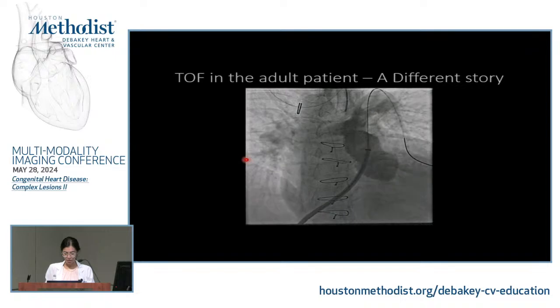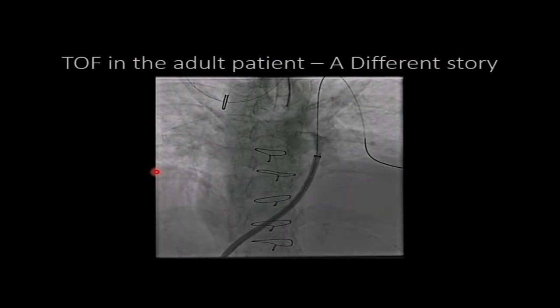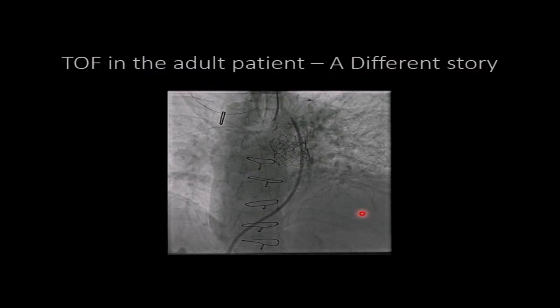Okay, so this same patient, where is the catheter? In the PA, and what do you see? Look at the RV here. Severe regurgitation. Again, remember PR is really faint. This is a patient with severe pulmonary regurgitation. You have to slow down your frame to see it. This patient underwent a transcatheter valve, and you see how now you don't have any regurgitation. Can you see that clearly now?